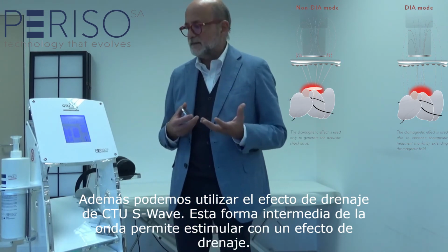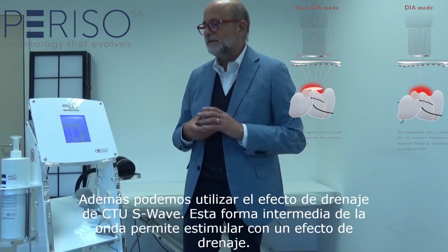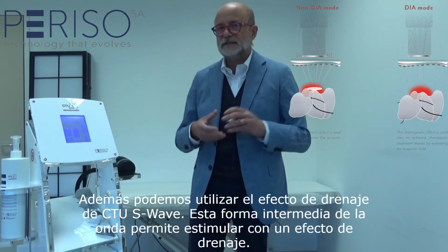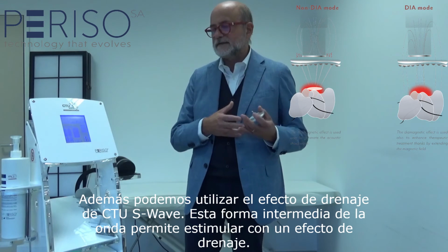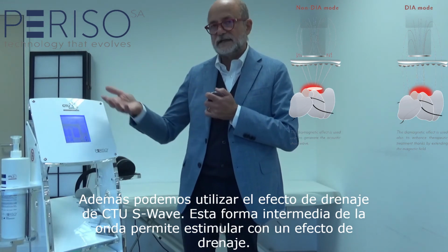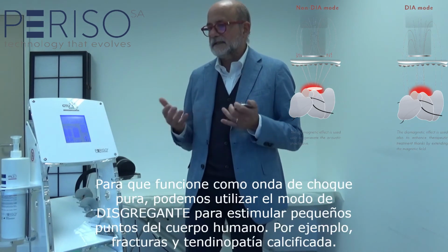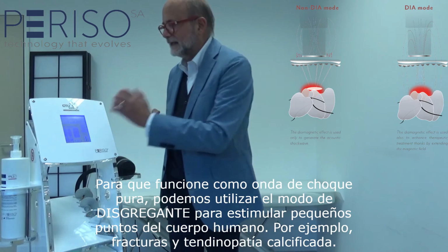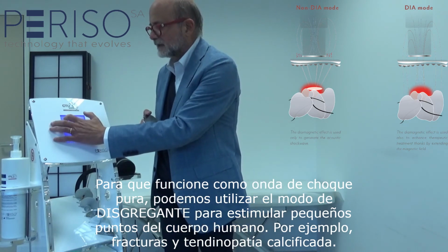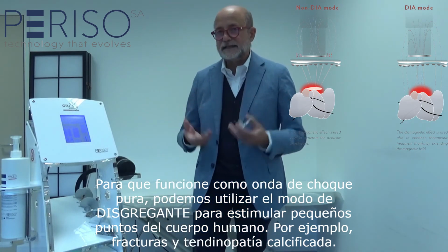This means that I have an intermediate shape of the shock waves between the narrow shock waves and the larger shock waves of the stimulating effect, and you can work in an intermediate way. Then if we need to work with a pure shock wave, I can work in a disaggregating effect.